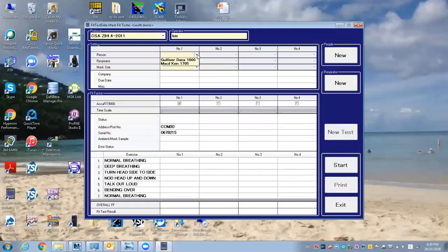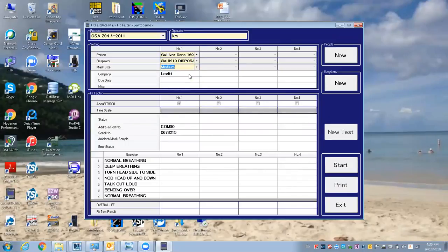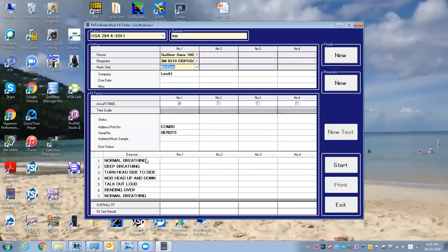the respirator, this one, and the mask size—it's a medium. These are all the exercises that we're going to go through.